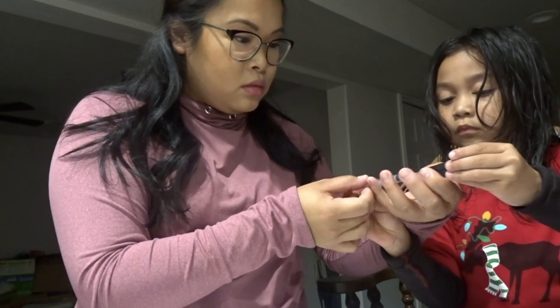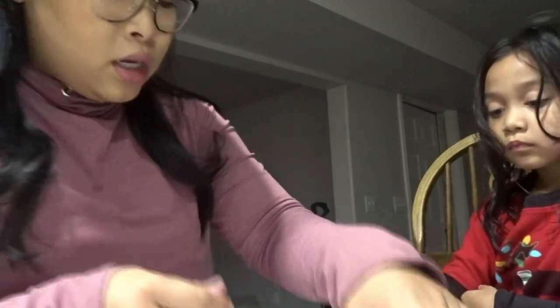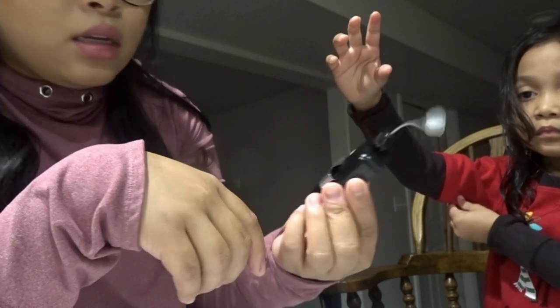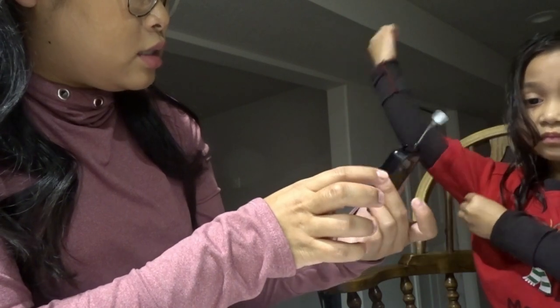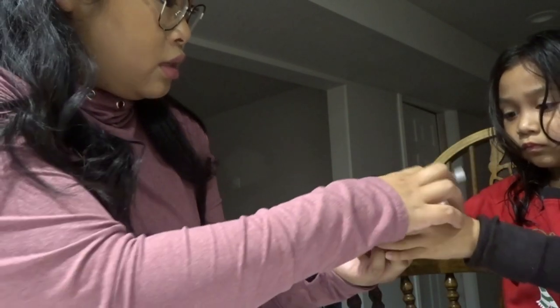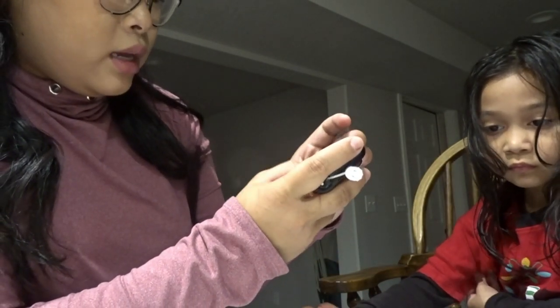Emma likes doing this part - I'm going to have her put the insulin into the cartridge. Good job! Now all the insulin's in the cartridge. We're going to put the cartridge back and snap it into the pump. Go ahead and push it down until you hear it click.